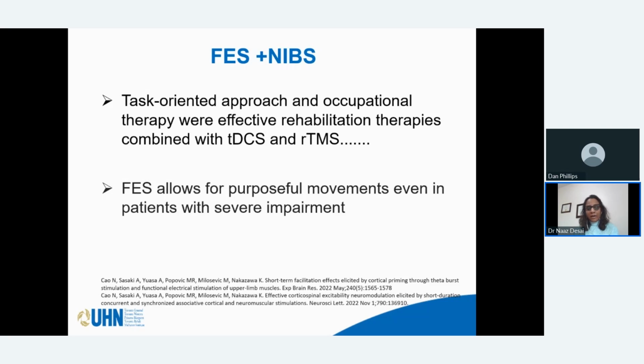And the thing that FES allows is, even for patients that are severely paralyzed or have severe impairments, FES allows them to perform purposeful movements with minimal assistance on their part, which is really a big deal because there are not many rehabilitation therapies out there where the patient can be involved in functional movements when they have high levels of impairment. They're typically just reduced to passive movements. So in that sense, I think that FES really offers a venue for exploring if there is room for further improvement in patient outcomes by this combination therapy.